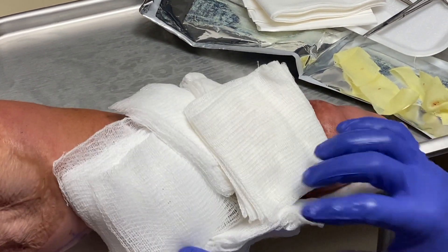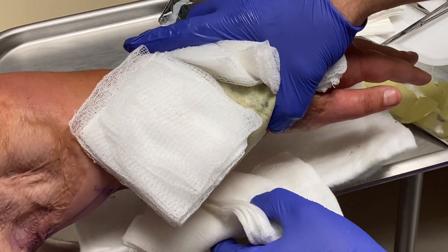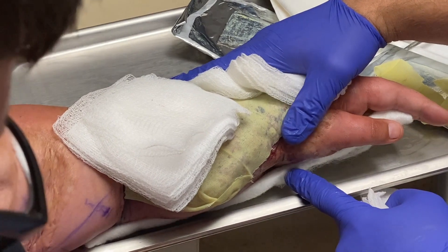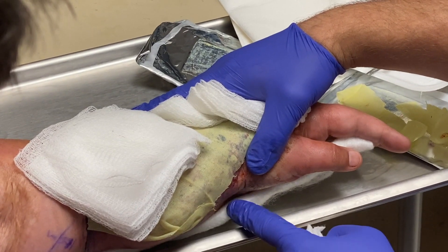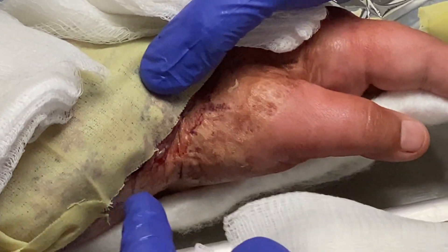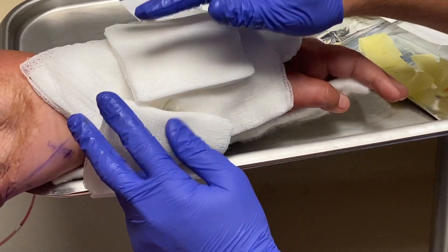The splint we're going to use is specifically going to be away from the flap — so not where it is now. You want it away from the actual flap site. The reason we use the splint is we don't want her flexing or extending her wrist. With a flap anywhere on the forearm, flexion or extension of the wrist could possibly rip out where the flap is inset, or even damage the actual perforators that supply the flap.